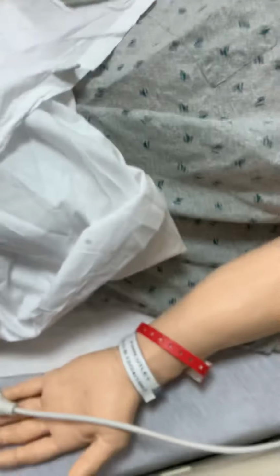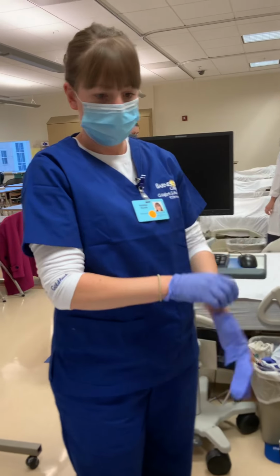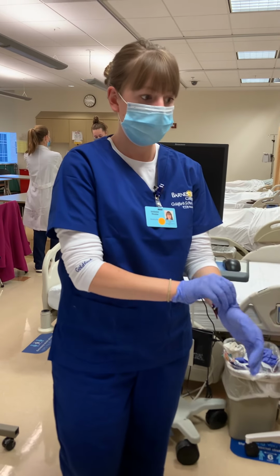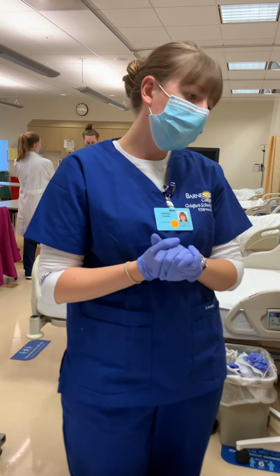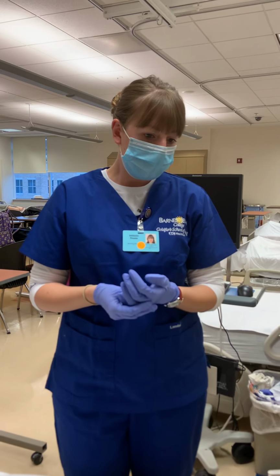Perfect, thank you. And ma'am, do you have any known allergies? Yes, I am allergic to latex. Okay, well I did see that in your chart, so I made sure to gather only latex-free items for the procedure today. Thank you. So your doctor put in an order to insert a Foley catheter for you. Have you had that procedure done before?